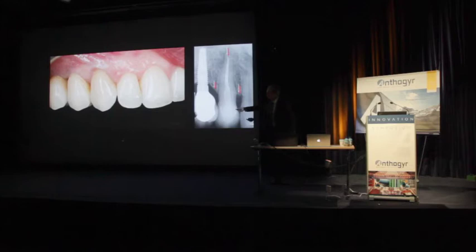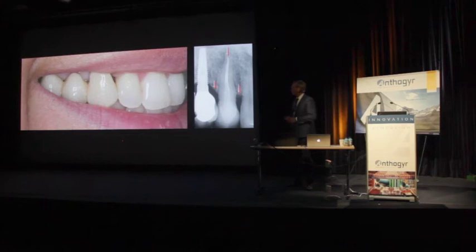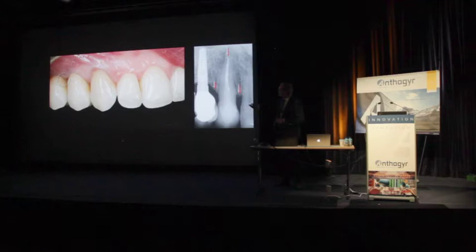Metal-free restorations are in place, single tooth restorations, two on the implants, two on the molar and the canine point. And this was a four papilla problem, black triangles. And this was now my end result. So three out of four were resolved. So the problem was fixed. Only one, the most difficult papilla, was not there yet. It is the papilla between the implants, which is very difficult to get back.